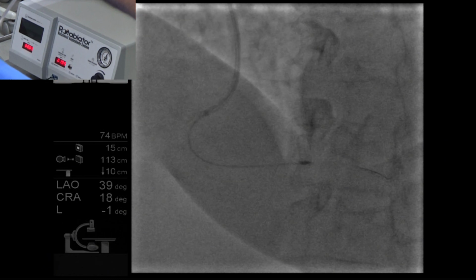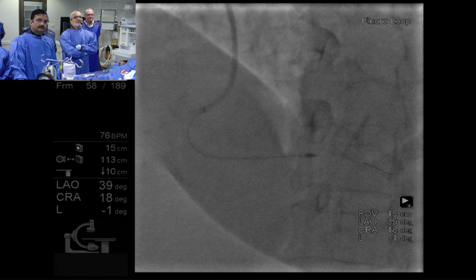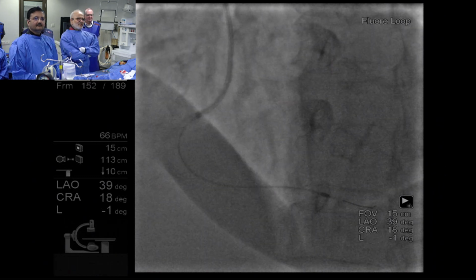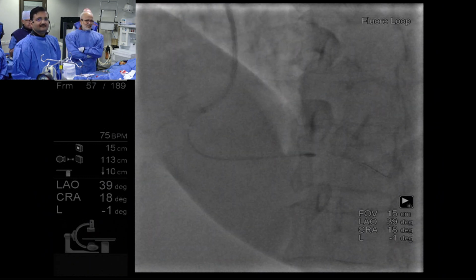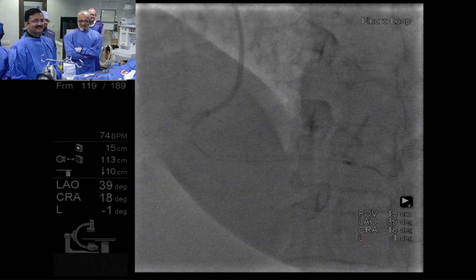Okay, fine. That is Brady. We'll wait. I think this is enough. This is one more pass. Okay, Sanjay feels that there should be one more pass. See, whenever my mind gets clouded, he's the one whom I ask. And then I don't think twice.